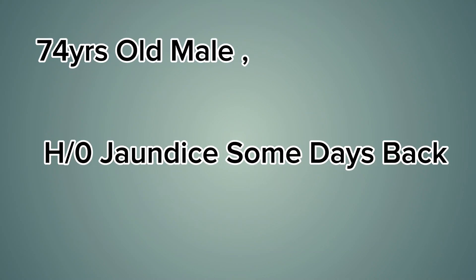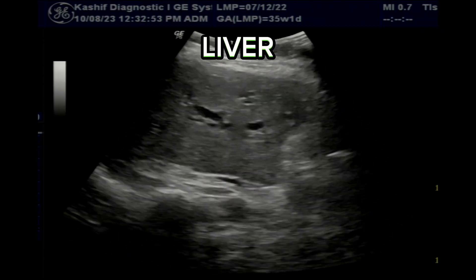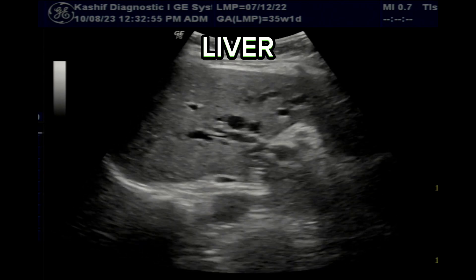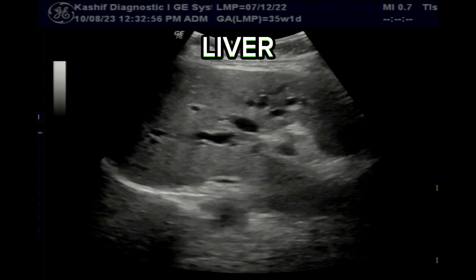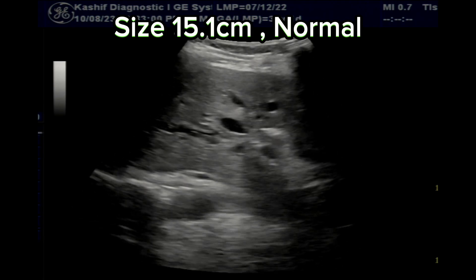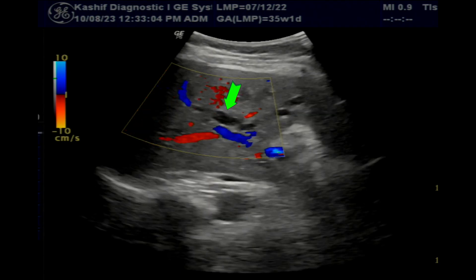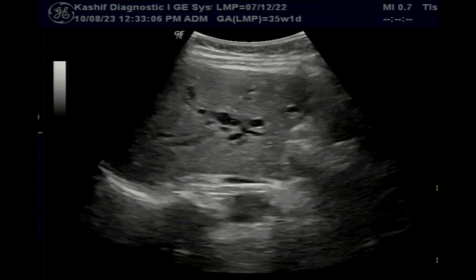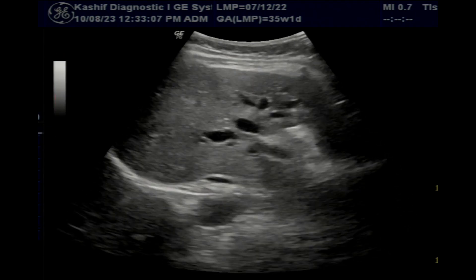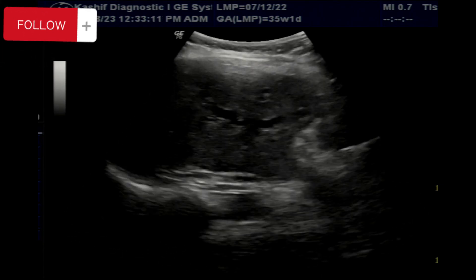This is an ultrasound scan of a 74-year-old male with history of recent onset of severe jaundice. This is the lateral decubitus position. The first images of the liver show dilated intrahepatic tubular areas; these are avascular. The liver is normal in size, texture is normal, and surface is smooth. This does not appear to be a case of liver cirrhosis or liver parenchymal disease.